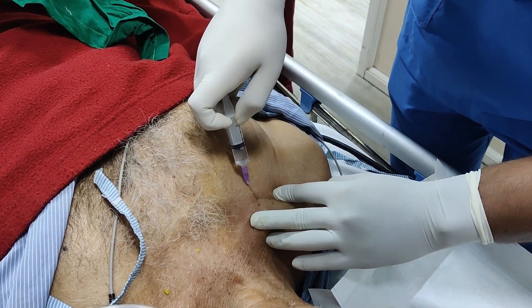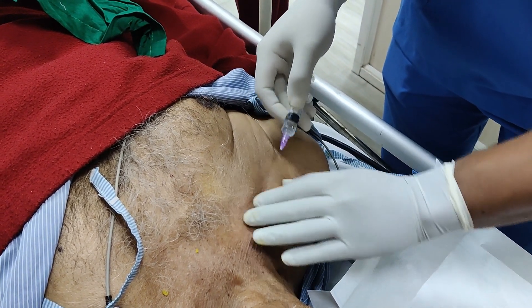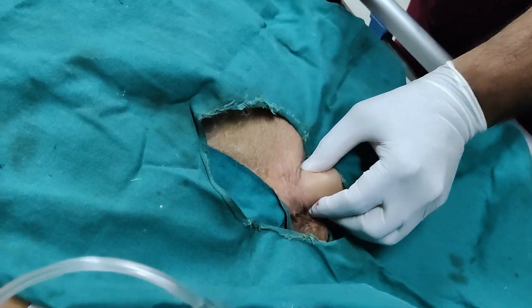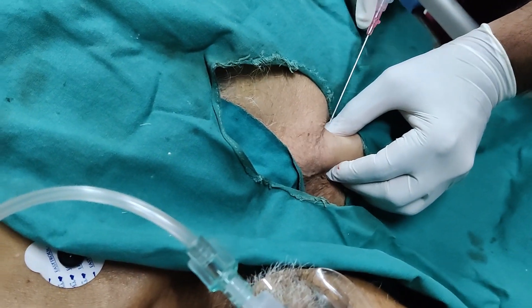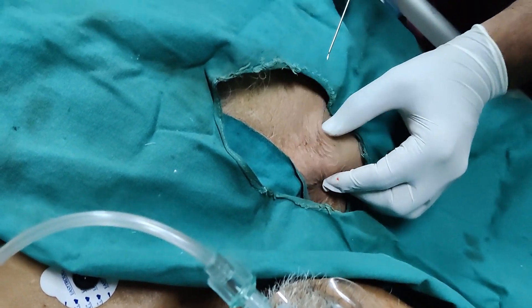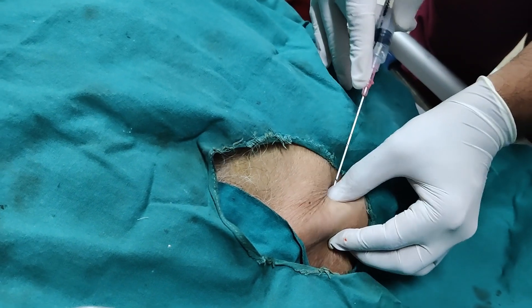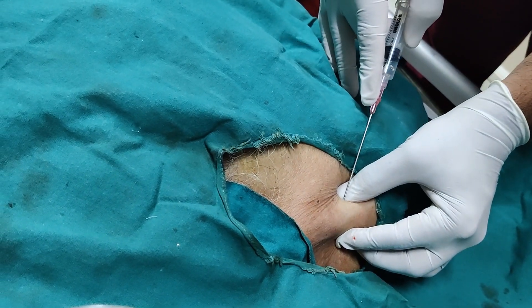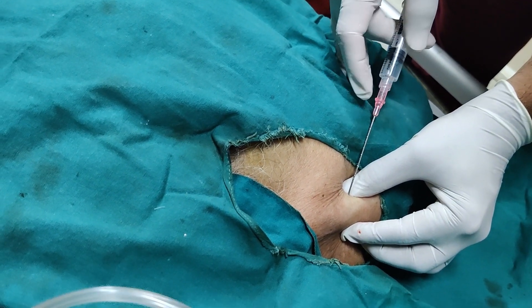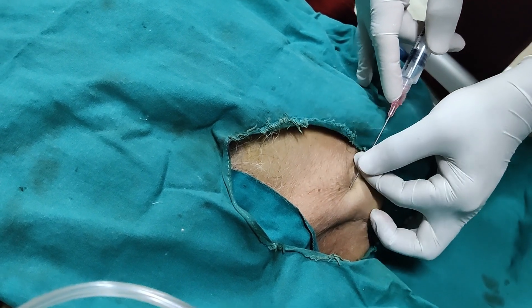Maintain gentle negative pressure on the syringe plunger as you advance. Insert the introducer needle, or optionally a finder needle, with the bevel facing along the needle insertion path. Continue to maintain gentle negative pressure on the syringe plunger as you advance the needle.